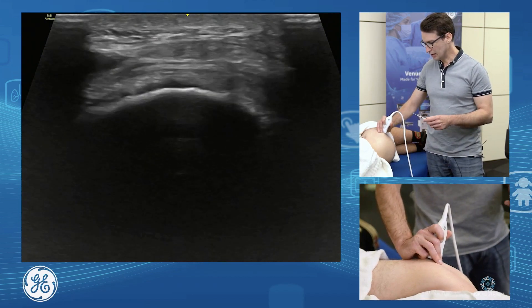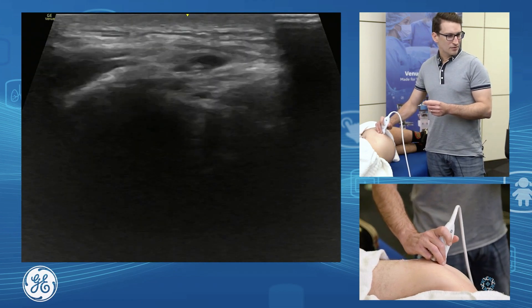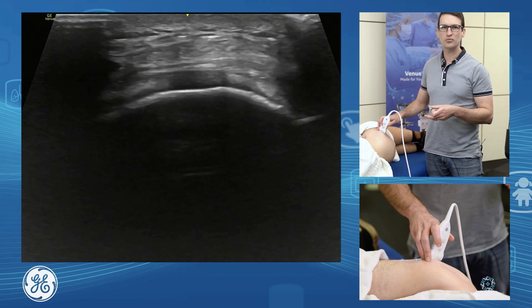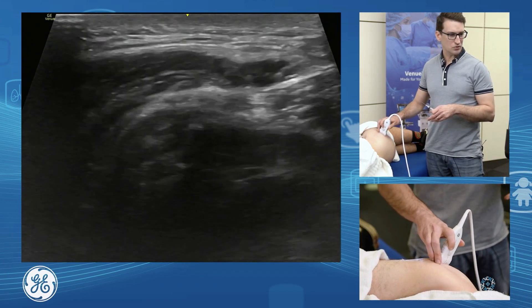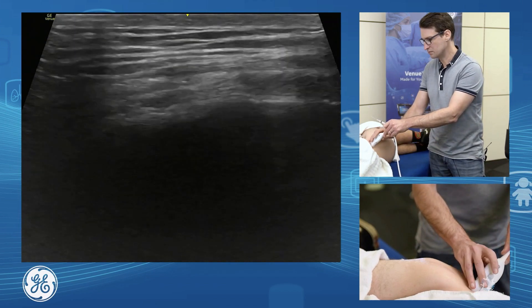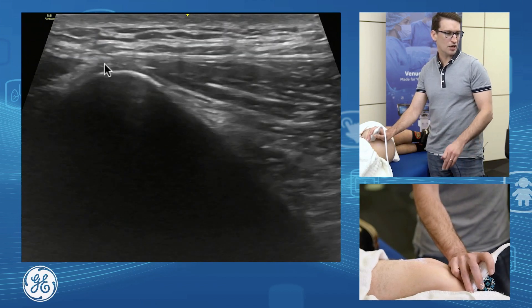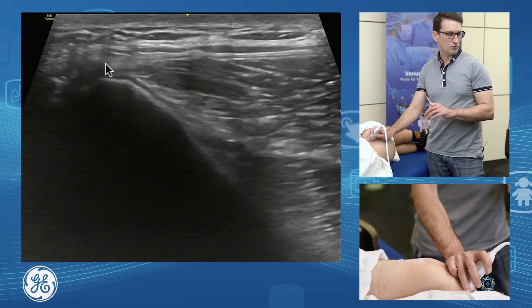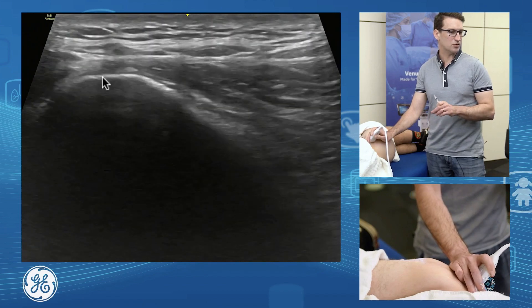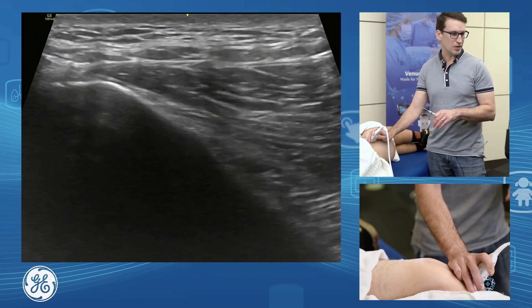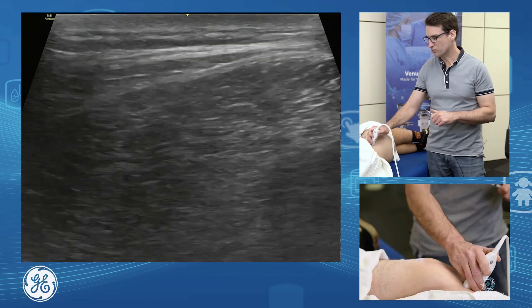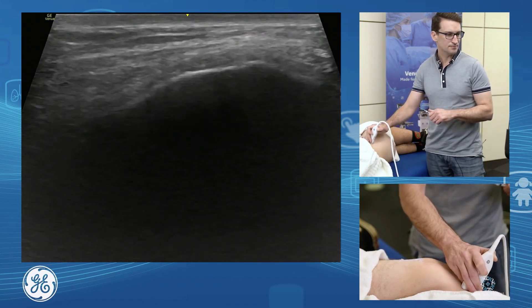Another thing to rule out with lateral hip pain is proximal iliotibial band syndrome — we occasionally see this in female runners. For this, continue up onto the iliac crest where we have our gluteus medius origin and the iliotibial band. The origin is just a very short, stubby little tendon. We want to assess for any thickening over the bone, and importantly look for edema in the underlying muscle and overlying tissues — it's not uncommon to have chronic change through this area.